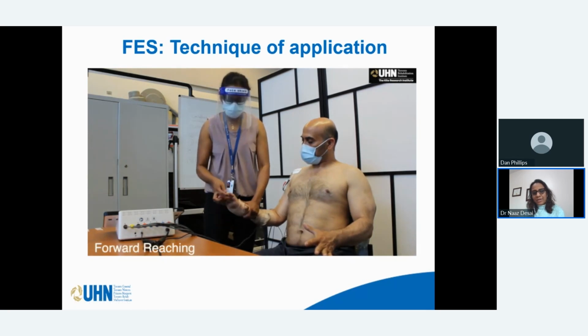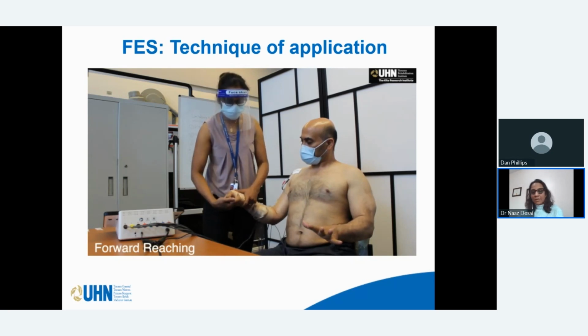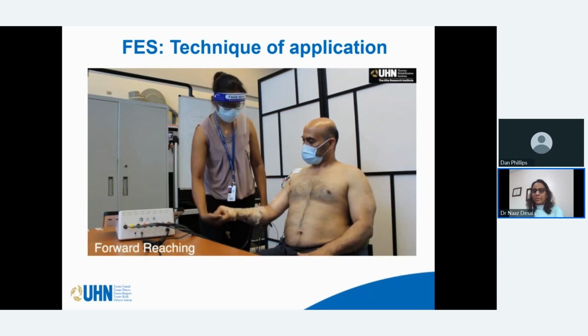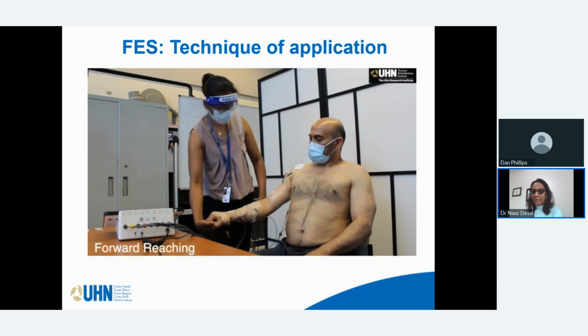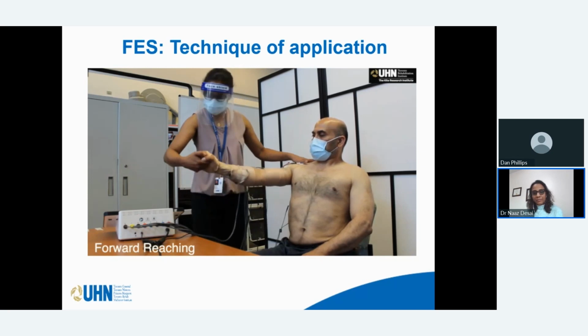And in a typical session, I would say that we're able to practice one particular movement for about 10 to 15 repetitions, after which fatigue sets in. So then what we do is we cycle through different types of movements, stimulating different muscles so that we are circumventing the fatigue issue.